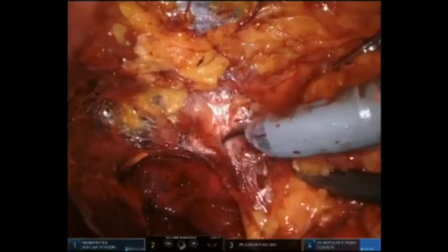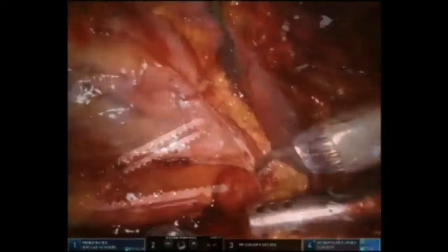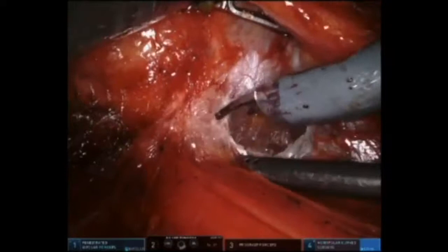Exposure of the renal hilum via the retroperitoneal approach involves removing the fat outside of Gerota's fascia to allow identification of landmarks and complete access to the vessels. Gerota's fascia is then entered above the psoas muscle and the renal artery is easily isolated, as it is the first structure seen from the posterior approach.